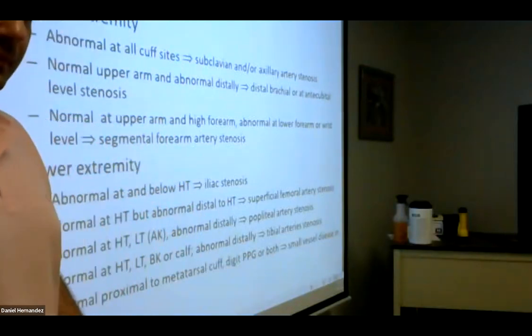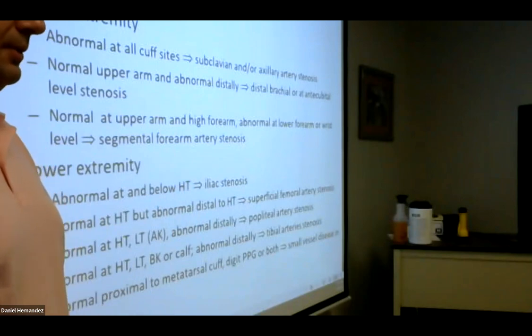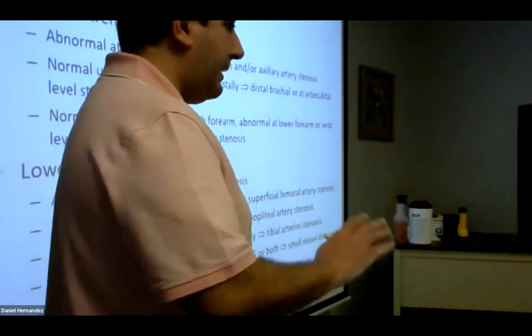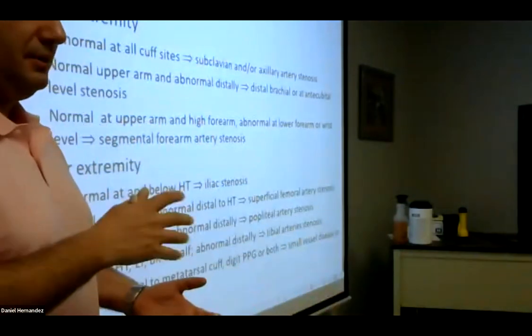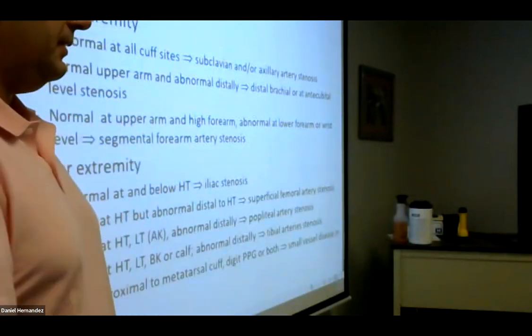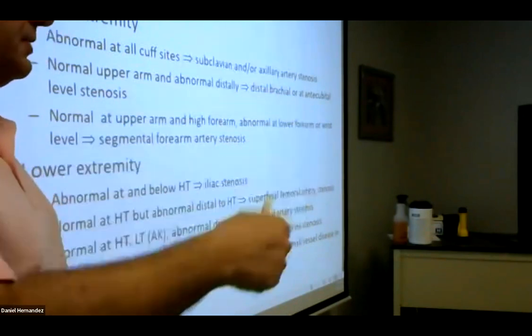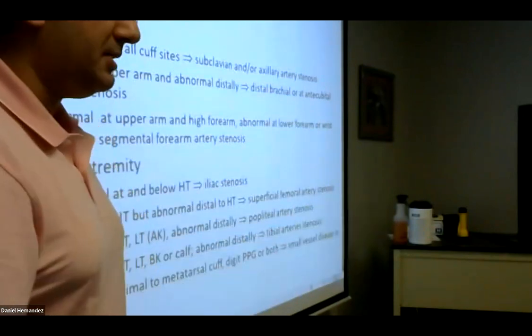So what if they have an ulcer literally where you're supposed to cuff? If they have a nasty ulcer, I get gauze and put stuff on it, and then non-adhesive wrap to wrap it. There are covers sometimes that you can put on the cuffs too, like a plastic disposable sleeve.